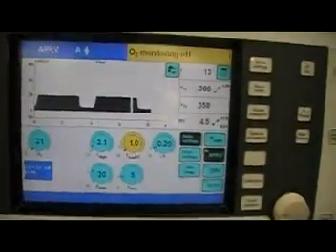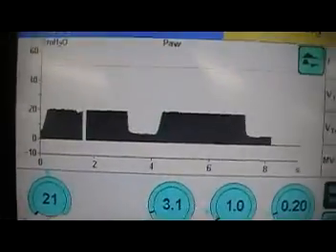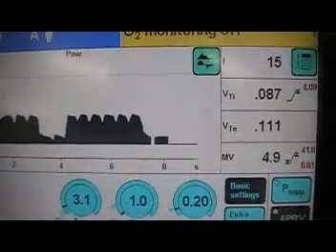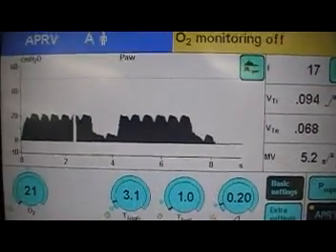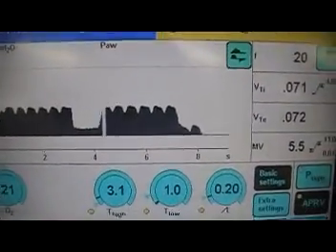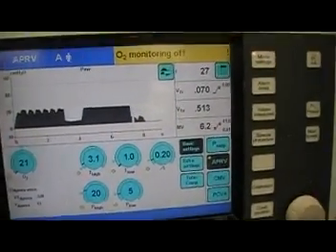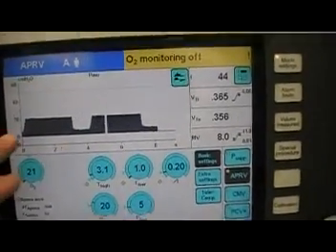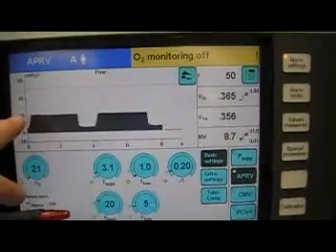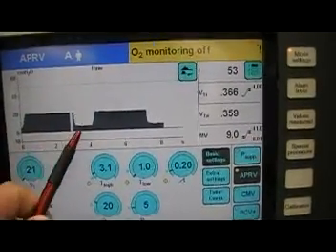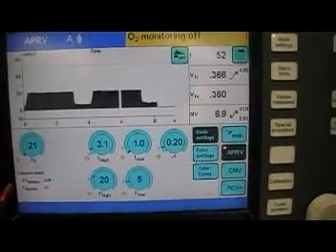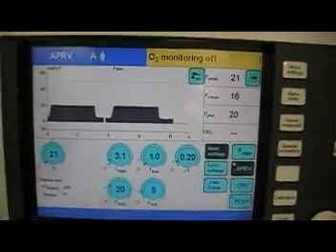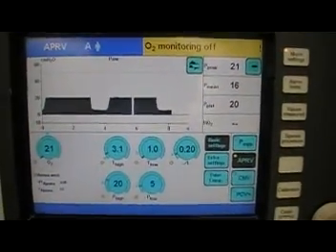This allows my patient to spontaneously breathe at any time during the cycle. You can see breathing during the inspiratory phase and now during the expiratory phase. You've got quite a high respiratory rate and creating a lot of pressure variations within the circuit. This mode is very unusual in that we have pressure control like you've seen in many other modes, but often radically applied so that we have very long inspiratory times and short expiratory times. The reason for that is we get quite high mean airway pressures, which can be useful for manipulating oxygenation in our patient.